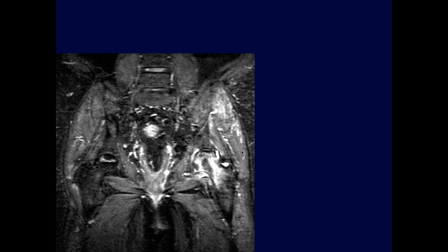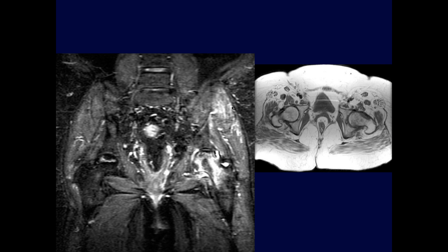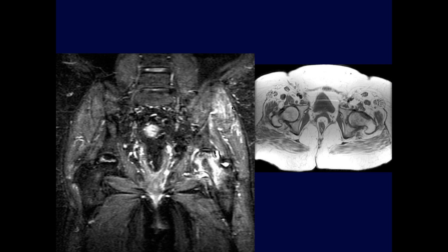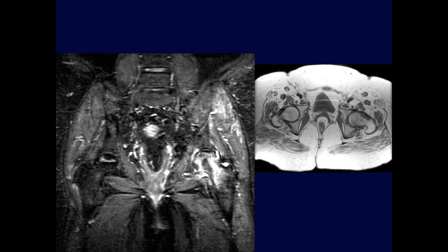A case of left hip pain. On the right femoral head there is a serpiginous area of increased signal raising concern for avascular necrosis (AVN). The left hip shows marked edema involving the femoral head and femoral neck, with gluteal muscular edema. There may be some collapse or indentation posteriorly on the left femoral head.